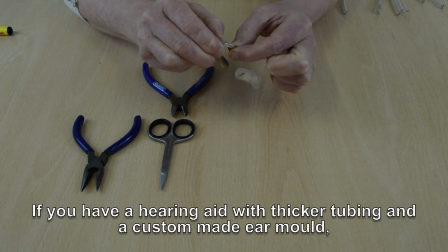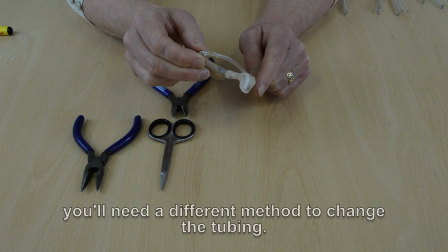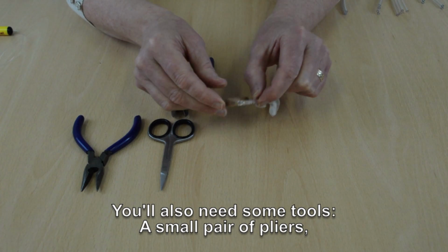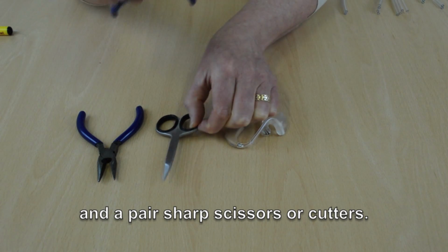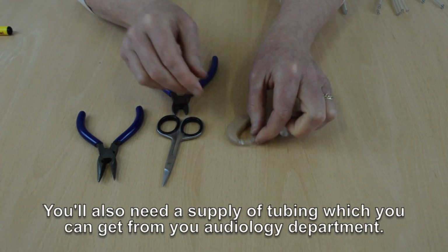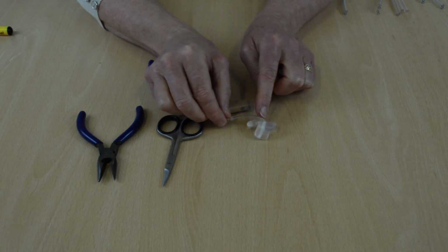If you have a hearing aid with thicker tubing and a custom-made ear mould, you'll need a different method to change the tubing. And you'll also need some tools. You'll need a small pair of pliers and a pair of sharp scissors or a pair of cutters. You'll also need a supply of tubing from your audiology department of the correct size.